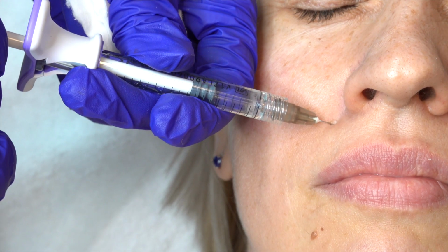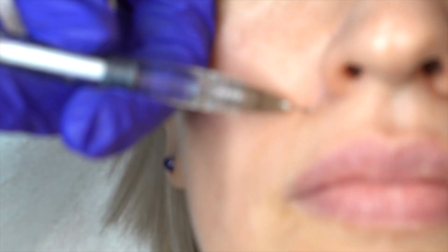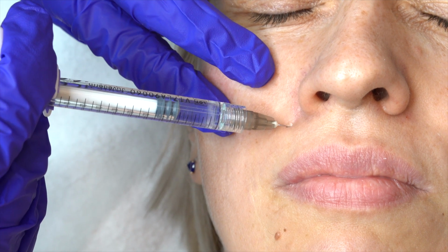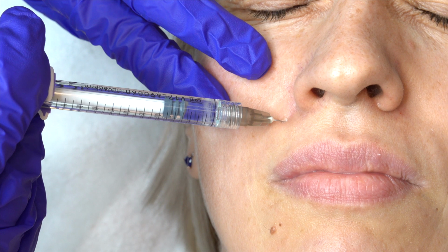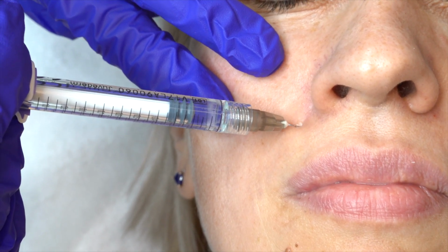Make your aspiration. And you can see that it's good here, and we can inject. I'm injecting now.